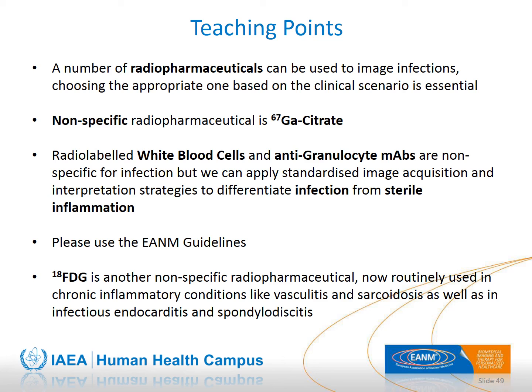FDG is another non-specific radiopharmaceutical and is commonly used in various inflammatory conditions, commonly in large vessel vasculitis and sarcoidosis, but it also seems to have found a role in infectious endocarditis, cardiac implant device infection, as well as in spondylodiscitis.